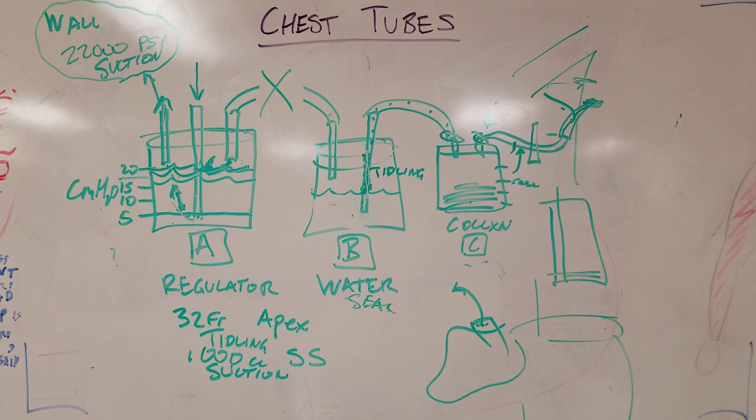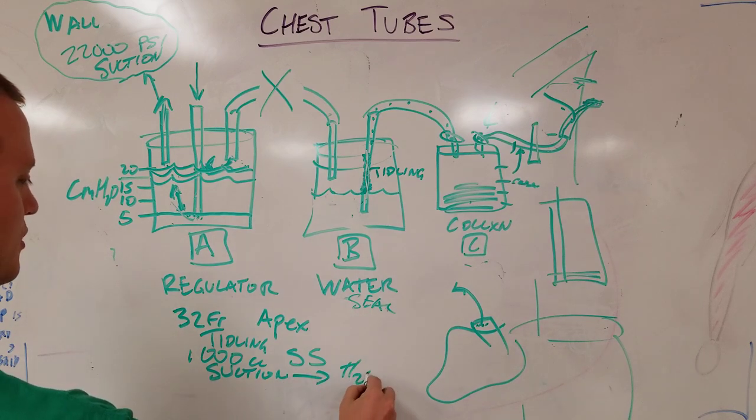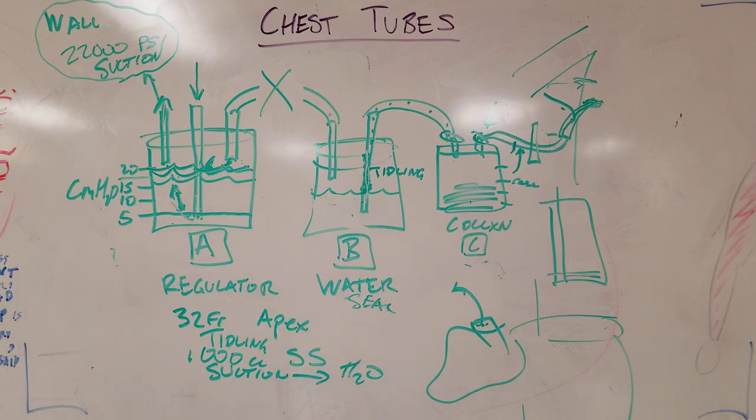So my plan is to put this chest tube to water seal and shoot an x-ray in 4 to 6 hours to see, you know, if his lung changes, if the fluid reaccumulates, if his pneumothorax reaccumulates, etc. That's it. That's the big overview of chest tubes.